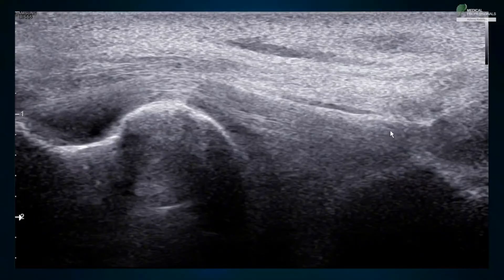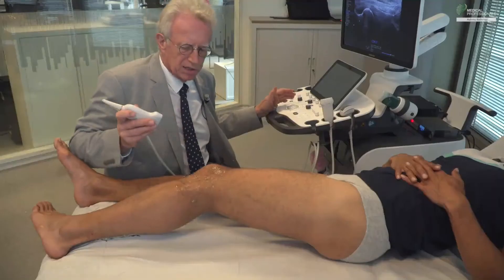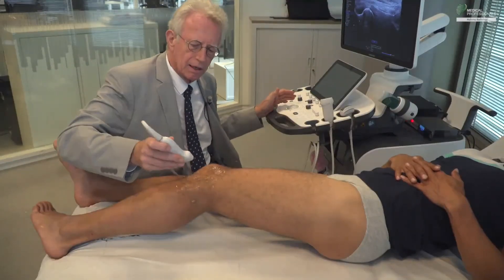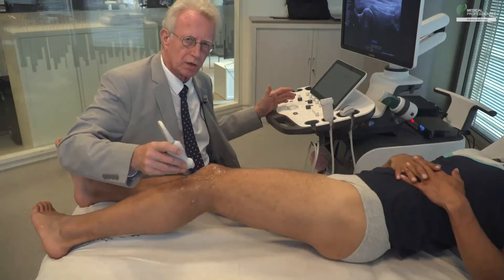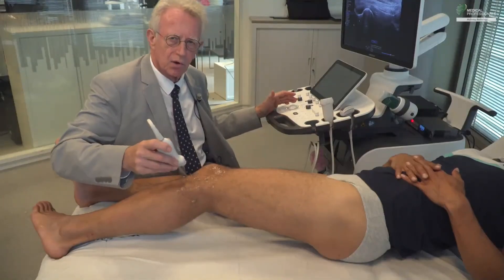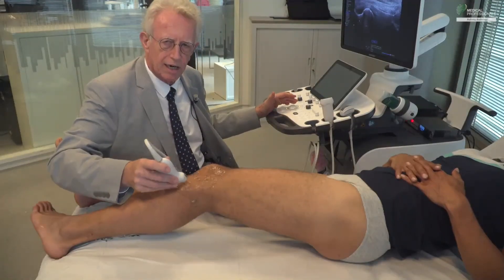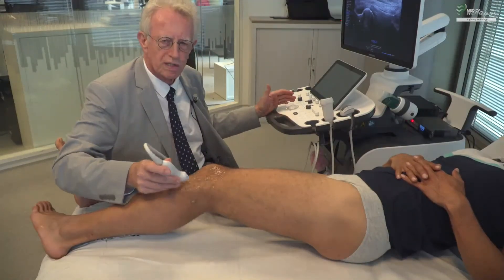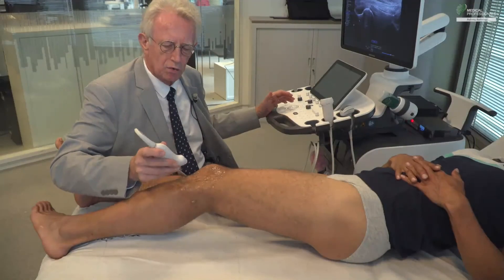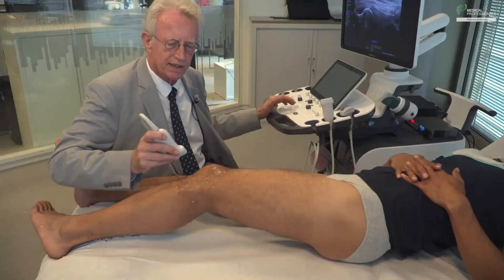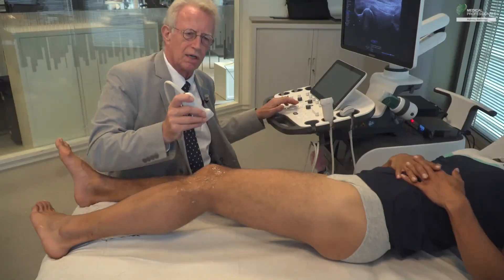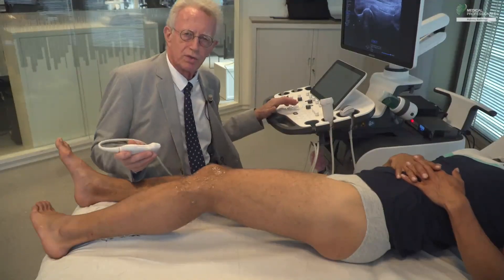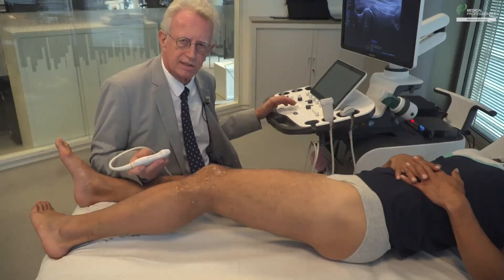In conclusion: the iliotibial band, popliteus tendon, anterolateral ligament, lateral collateral ligament, lateral meniscus, and biceps tendon — this side of the knee is rich in structures, and we really have to study it systematically to be sure not to omit anything.